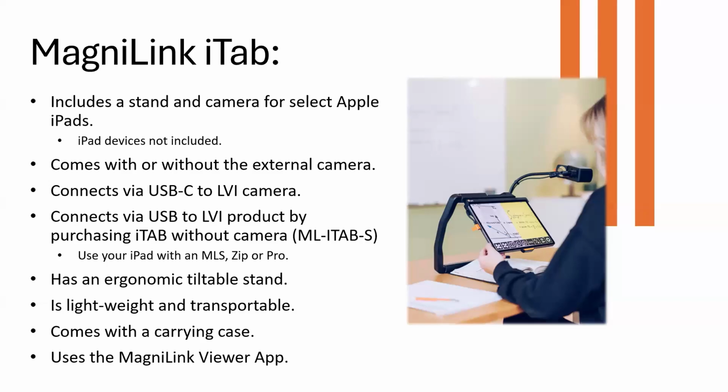It's really cool software because it knows if you're connected to one of our distance cameras and it adds those features in. If you're not connected and you're just using it with an iPhone or an iPad, those features just don't appear. It's smart software and it figures all of that out. So that's really, really cool.